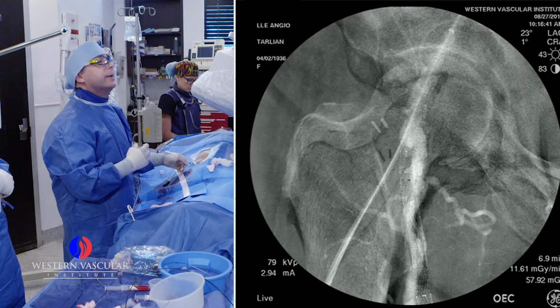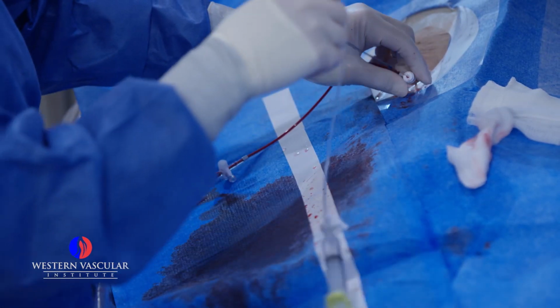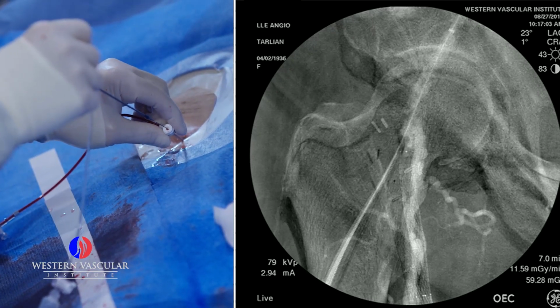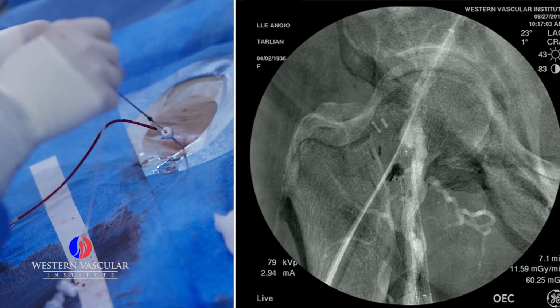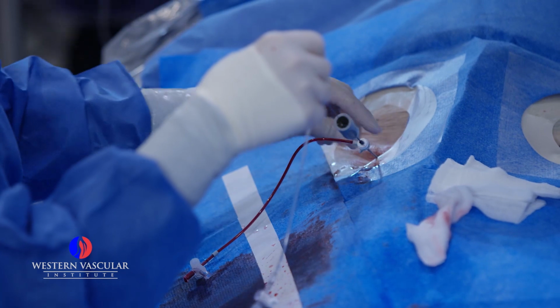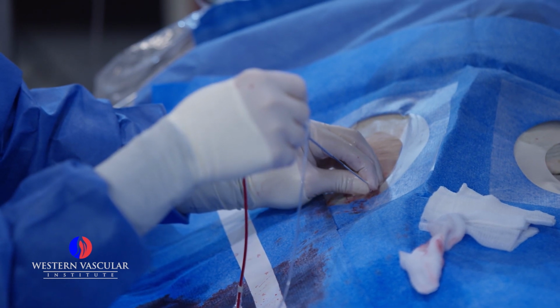And you can see the balloon coming down to meet the tip of the sheath there. So what we'll do, we always open the side port. Live. We pull them both back together. And that's right about where the sheath and the balloon meet. So we advance the plug and we hold it there for about 30 seconds so that it adheres to the wall of the artery.